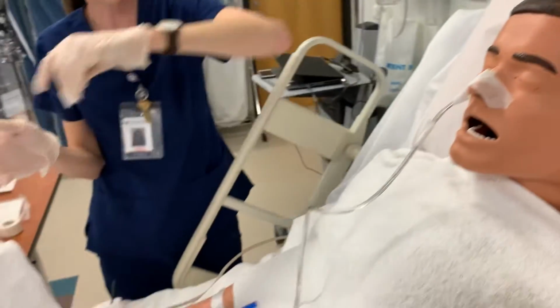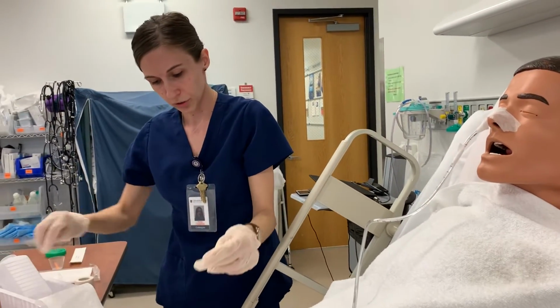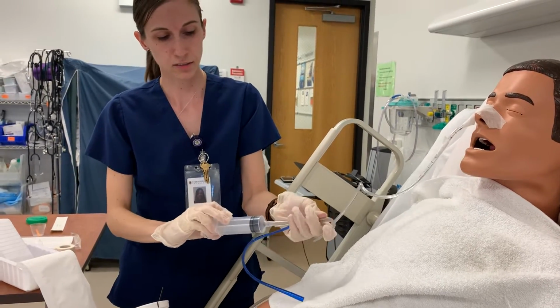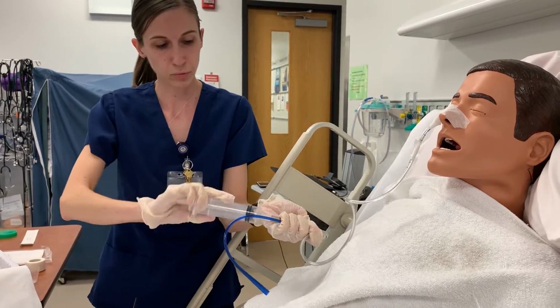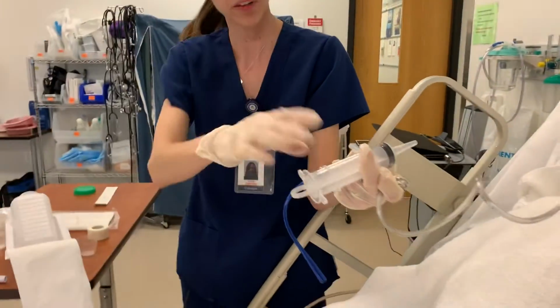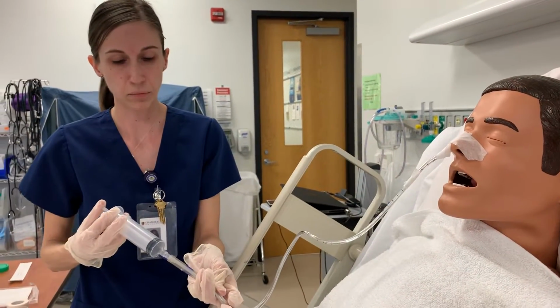Okay. And so then now at this point, I would take my stethoscope again. I would auscultate my client's breath sounds, their lung sounds. And then I'm going to, again, see how my patient is doing. I'm going to inject here. I'm going to aspirate about 5 to 10 cc's or milliliters of the gastric content. I have a little cup here with my pH strip, so I can remove that. Place the gastric content. I'm going to take my pH strip. I note that it is acidic, so I can pull back up my gastric content and then reconnect it, release that, and insert that back into the client.